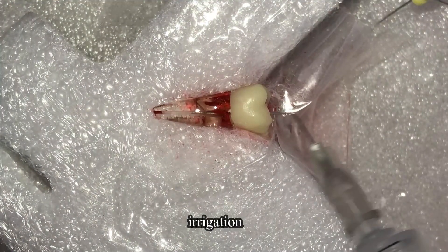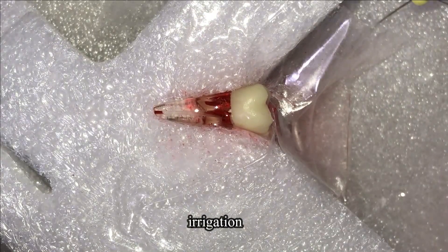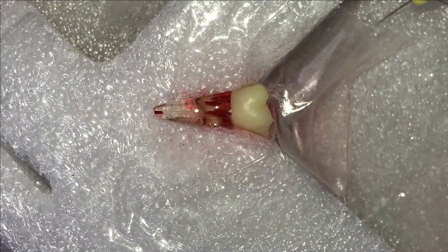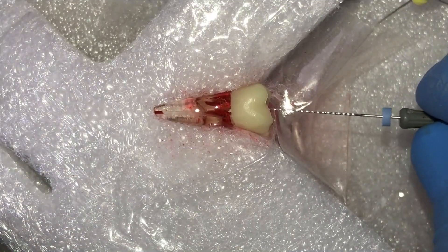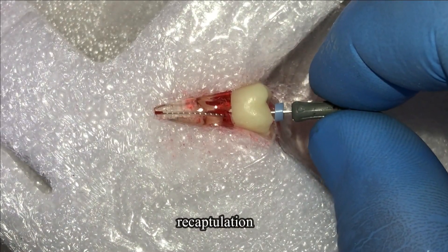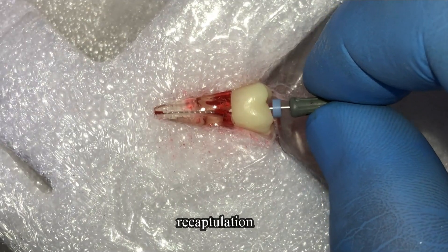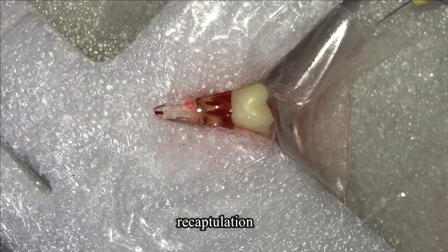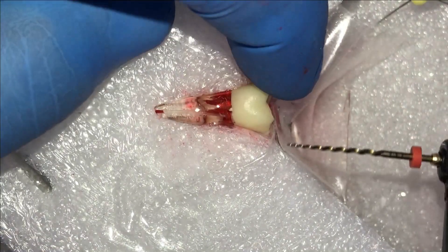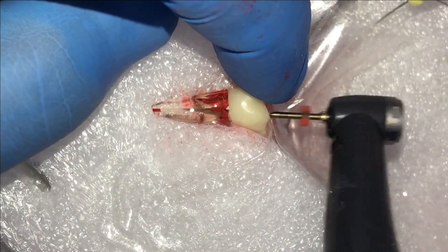We irrigate the canal, and after irrigating the canal we will recapitulate the canal and continue our preparation.